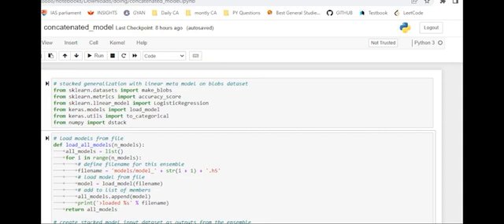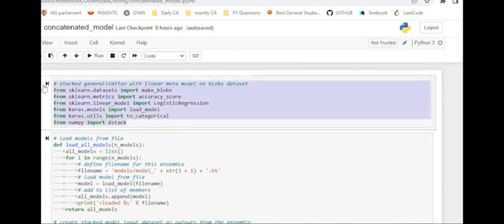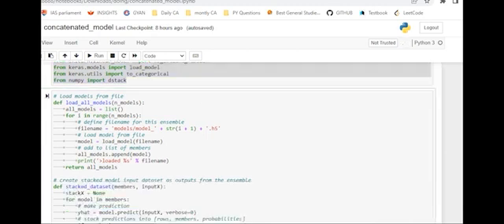Here comes the concatenated model, which utilizes the models that have been trained and tested before to perform classification of cancer versus non-cancer data set. Here we're going to use neural networks as our intermediate models. So we require importing of libraries and packages from Keras. Then we should also be using the stacking functionality provided by scikit-learn. So we shall utilize the wrapper provided by Keras also. Now we shall look into the defined functions.